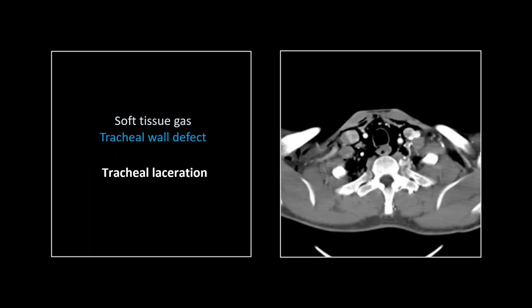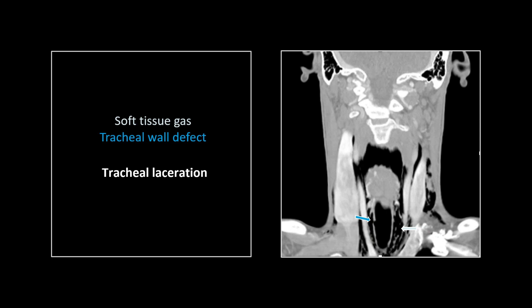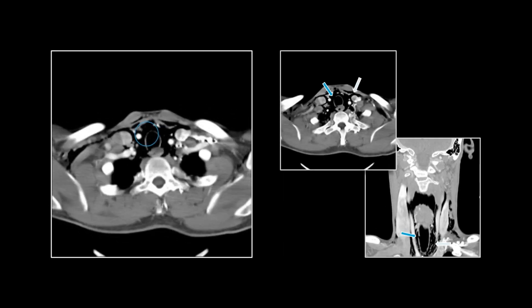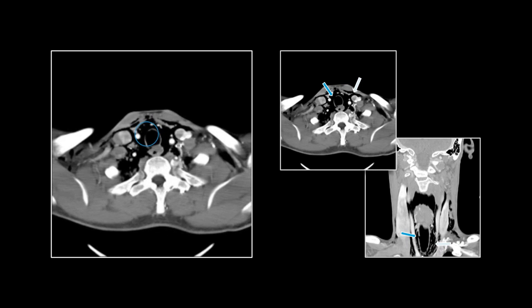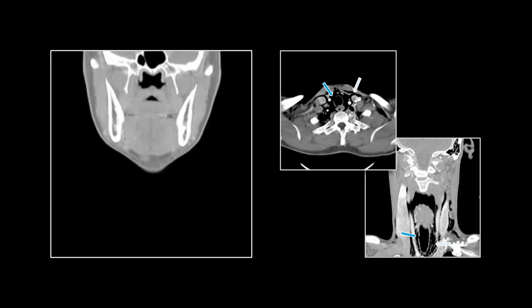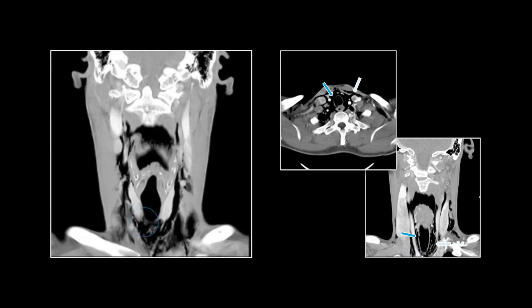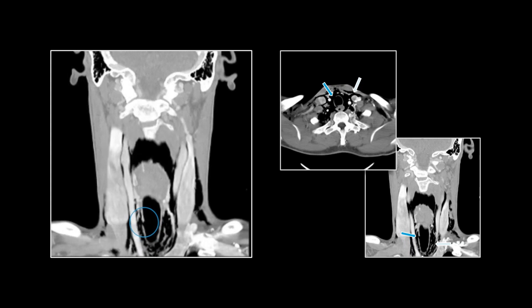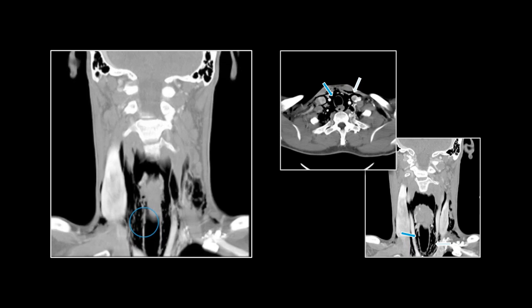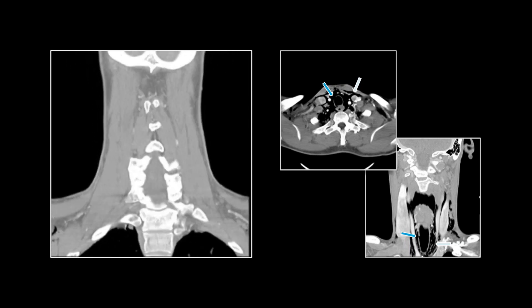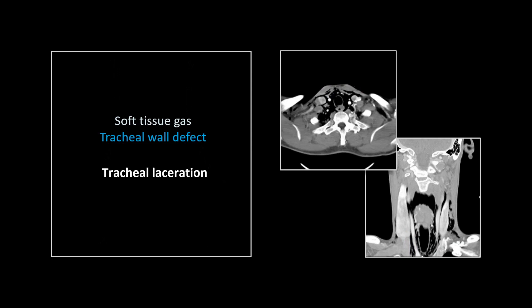This is pretty straightforward — just to encourage you to look at all planes and on all windows. This is a tracheal laceration. You can see there's gas all throughout the neck, but it's pretty hard to appreciate the tracheal wall defect on the axials. When you go to the coronals, there it is — it's lying in the axial plane, but there's clear disruption of the trachea. This was done with a steak knife. Here's the axial showing that small incised wound, and beautifully shown on the coronal right there — the source of all that soft tissue gas. That's a tracheal laceration.